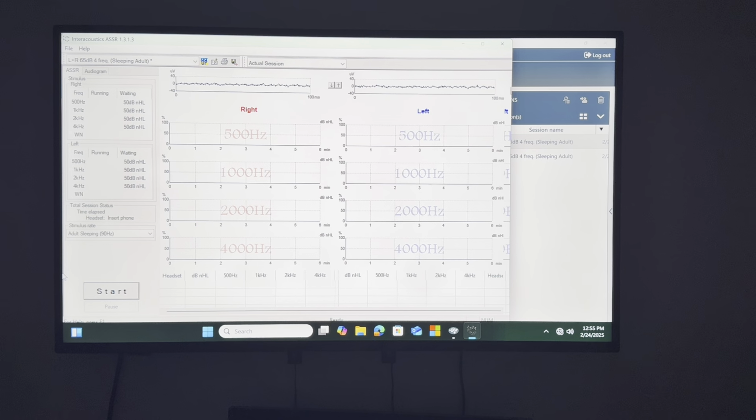When the time domain continuous EEG is converted, it's broken down into small chunks, probably 50 millisecond, 100 millisecond chunks, and then they're converted into the frequency domain. And you look at the response in the frequency domain. For each frequency, you will have the response amplitude as well as the phase. So the Eclipse system implements both amplitude at the repetition rate and its harmonics, as well as phase analysis.